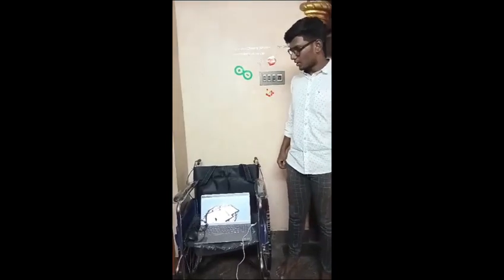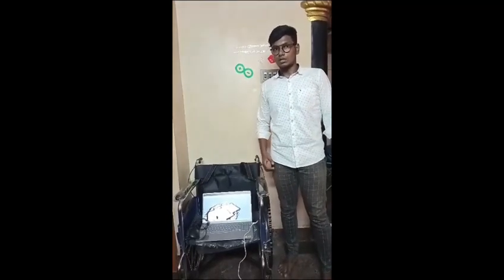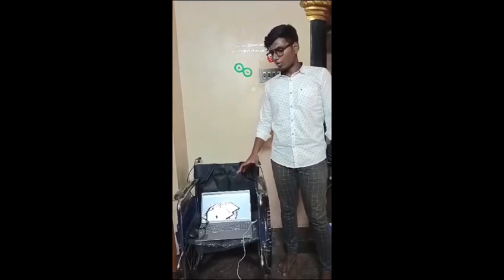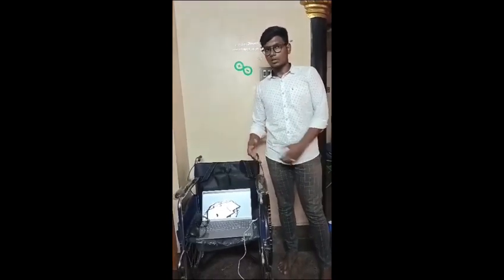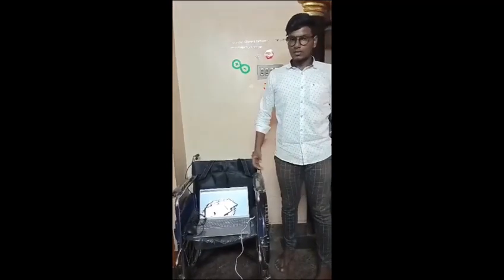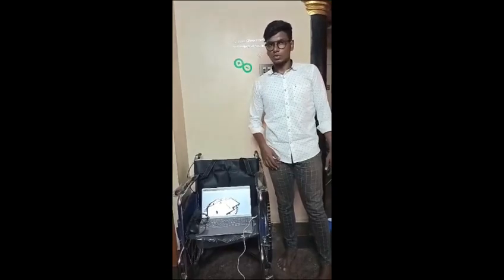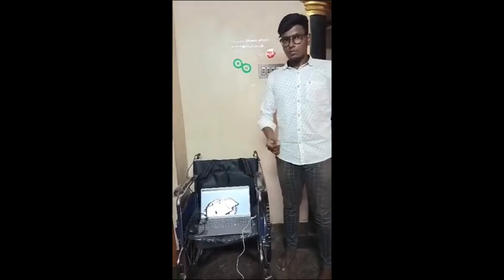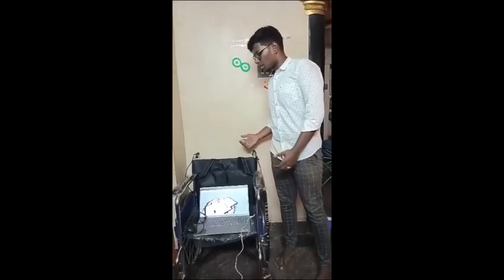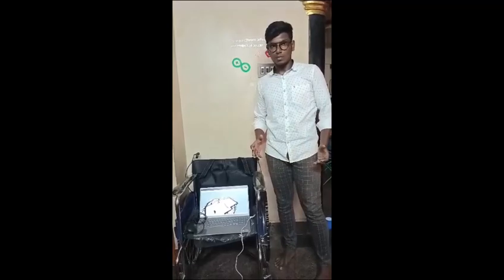Our innovation topic is making an autonomous wheelchair from an ordinary or normal wheelchair, and we are integrating some ROS and IMU sensors, wheel encoders, and LiDARs for making the localization of the robot. Localization is nothing but the robot knowing where it is. Our wheelchair should know where it is, right? And we are making this wheelchair for an indoor environment.